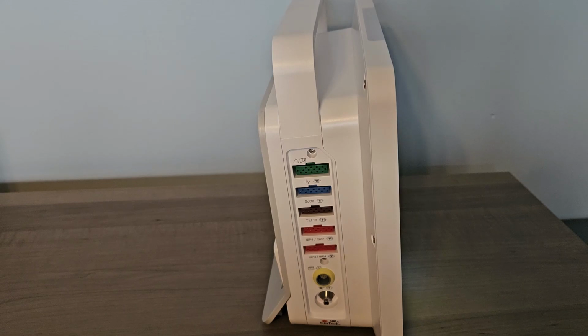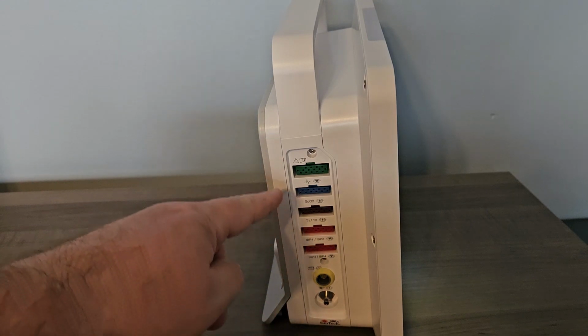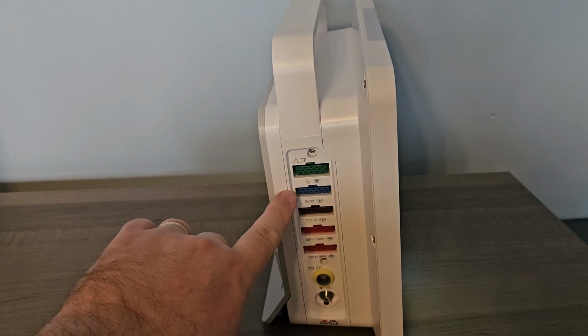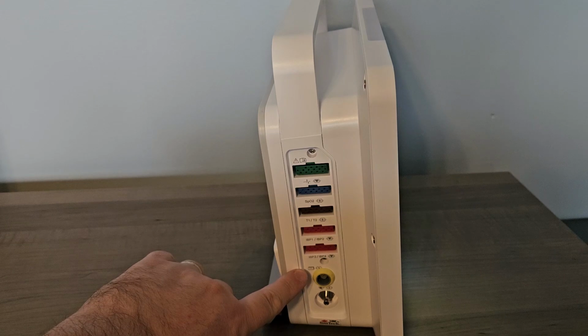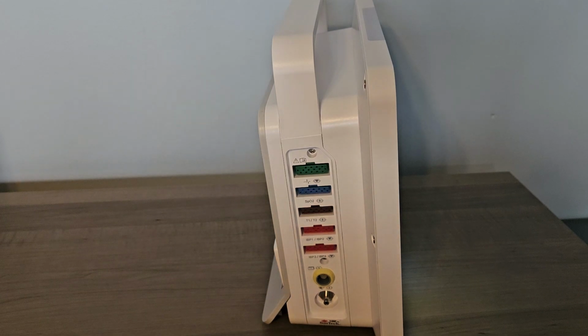Each port is color-coded to the extension cable that plugs into it, and each accessory only attaches to its own extension cable. Green is ECG, blue is SpO2, brown is temperature, red is invasive blood pressure, yellow is EtCO2/dual gas, and the silver port is for your non-invasive blood pressure tube. Any of these cables can be plugged or unplugged at any time.